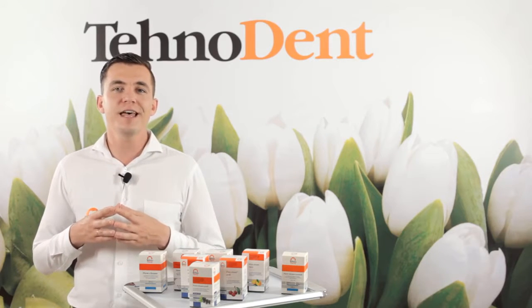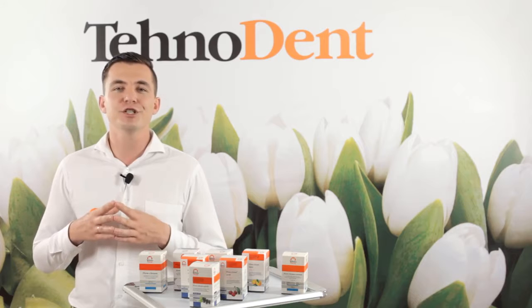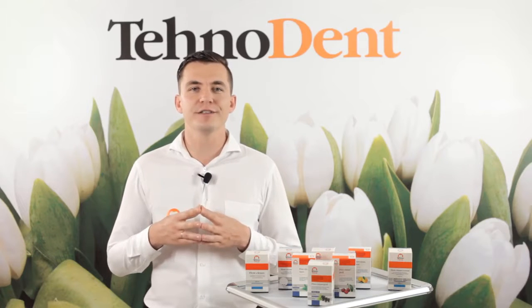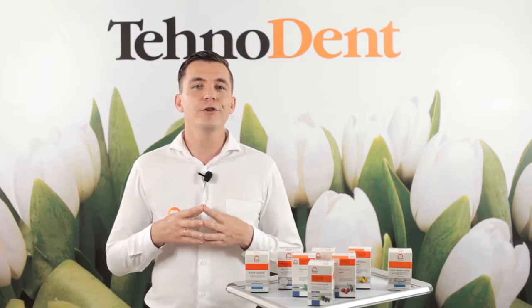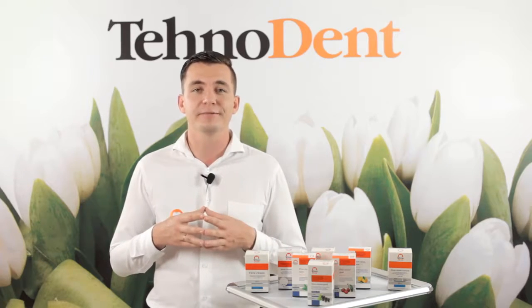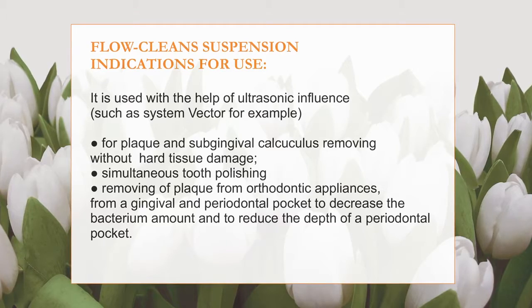After the influence of the abrasive jet, the surface becomes rough. Therefore, there is no necessity for etching with acids before restoration. At stump processing, before fixing the crown, the stump surface has numerous retention points and roughness that promote increased adhesion of the fixing cement. Powder Flow Cleans Corundum is used according to the instructions attached to the sandblasting device's tip for the preparation of teeth.